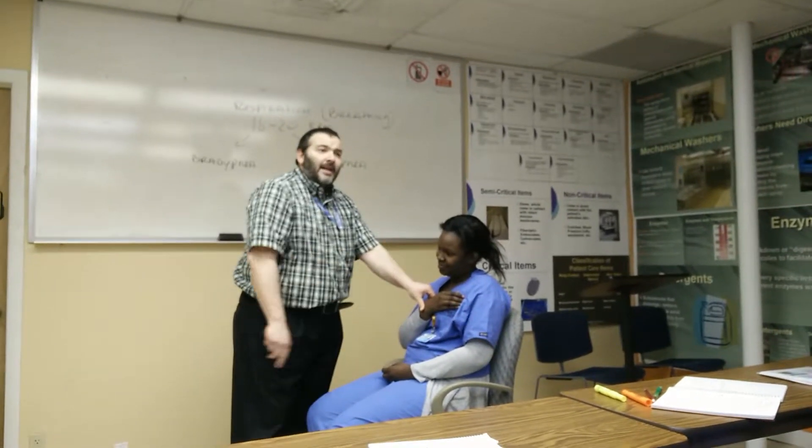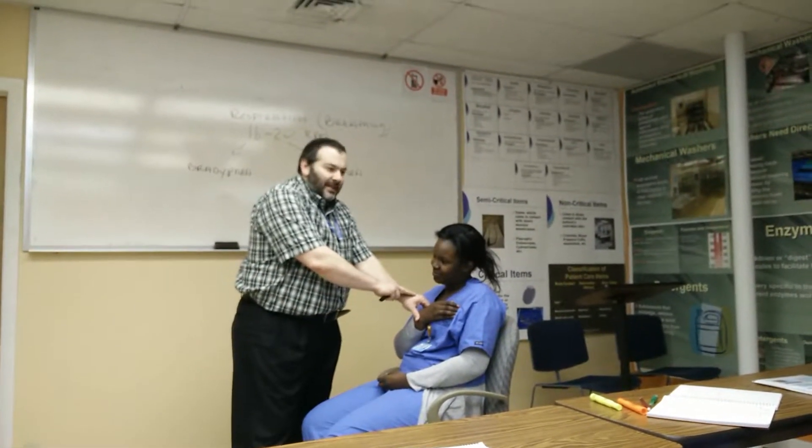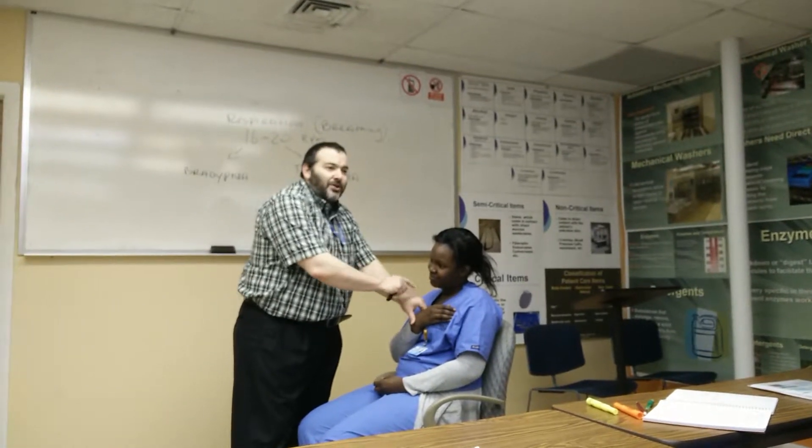Steve is going to say he's measuring your pulse. The patient asks why their hand is on their chest — and the answer is that the hand has to be about the same level as the heart. It's a little white lie, but the fact of the matter is that the first 15 seconds of measurement are actually used to measure the patient's breathing, before the patient becomes uncomfortable.